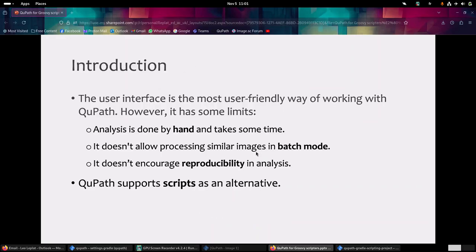The user interface of QuPath is the most user-friendly way of working with the software, but it has some limits - it can take a lot of time, and also doing the analysis by hand doesn't encourage reproducibility, which is something very important when you want to publish papers. So as an alternative, we have scripts.